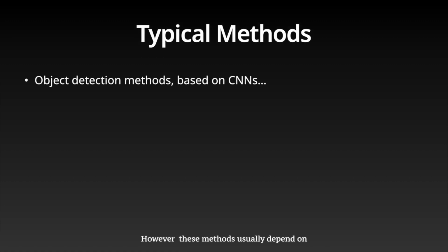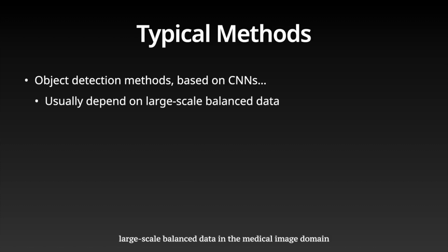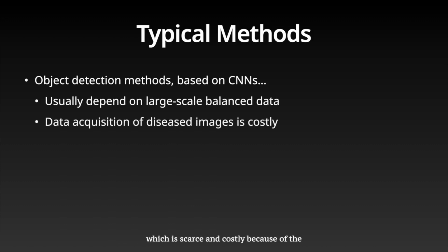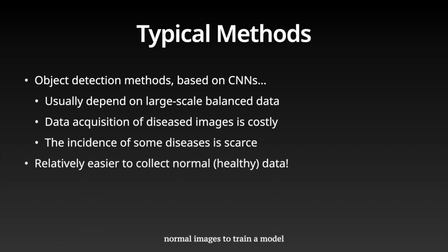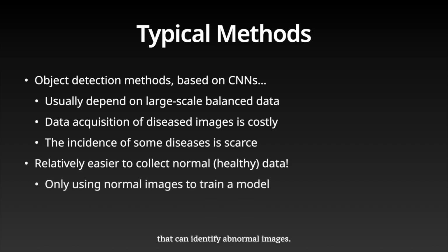However, these methods usually depend on large-scale balanced data in the medical image domain, which is scarce and costly because of the concern for patients' privacy issues. Therefore, it is promising to only use normal images to train a model that can identify abnormal images.